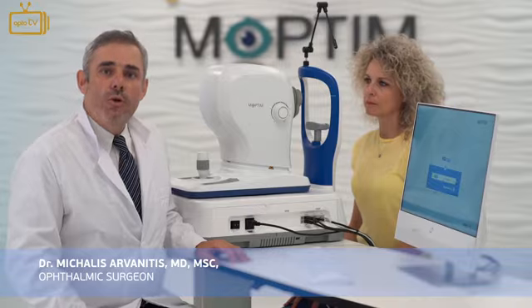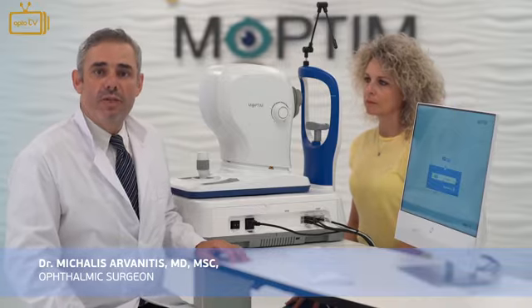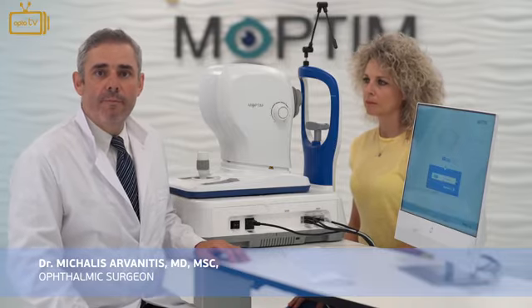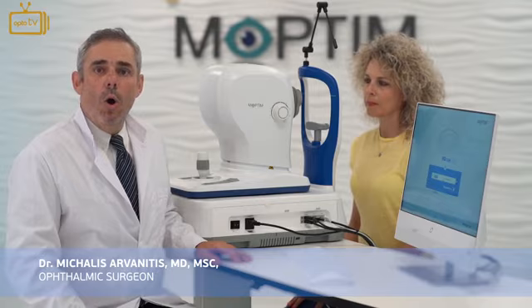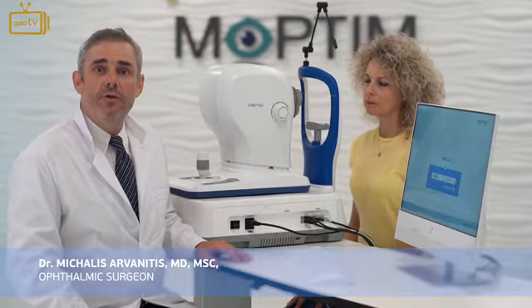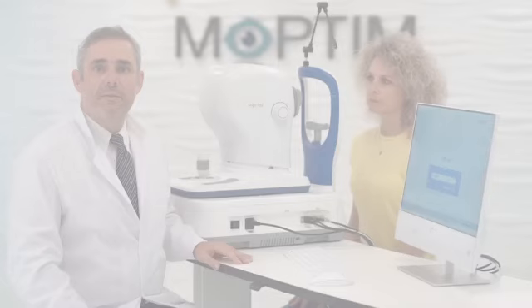Today, we will show you the first video user guide of MOCEAN 4000 OCT with VASCAN optical microangiography. Our purpose is to show you by very simple steps all you need to know from A to Z in order to acquire high-resolution images and obtain a very accurate diagnosis for your patient.